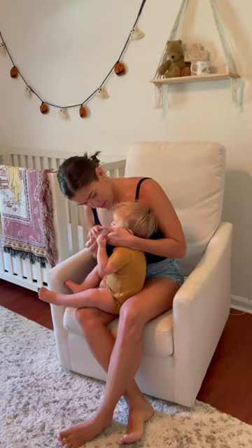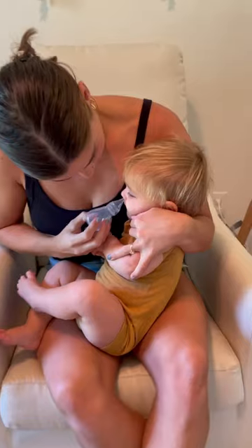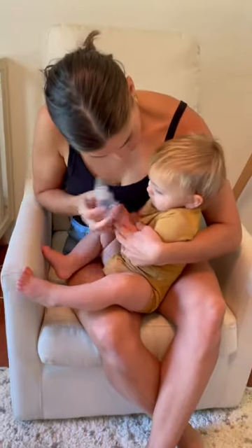Here you can see me introducing it to my son and gently putting it in his nose. This product has adjustable suction so it really is super gentle on their little noses. He didn't mind it at all.